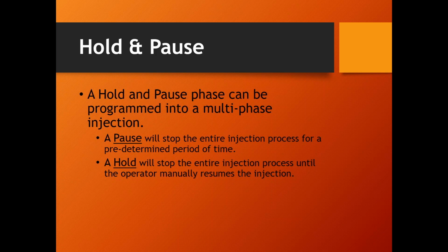We're gonna arm, lock, arm. What didn't happen? Arm. Hit the wrong button. There we go. Now, when we do this injection, it shoots contrast, then there's gonna be a 5-second pause. And without the operator intervening, the injector takes over on itself. And then the injection is finished.